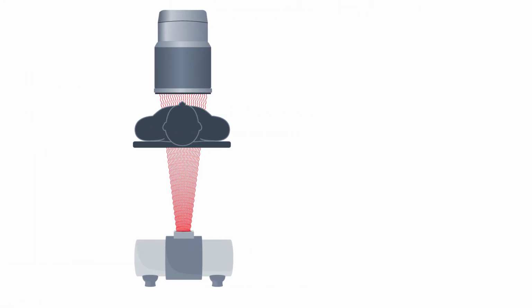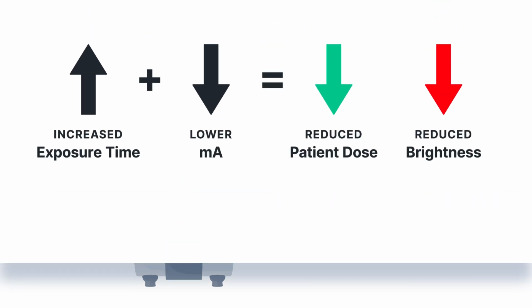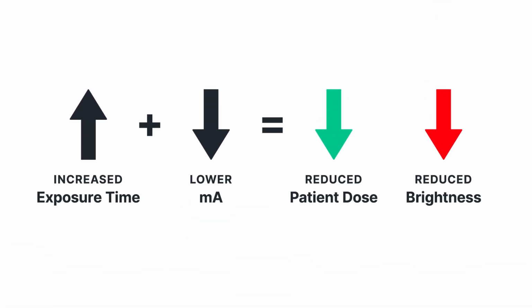In fluoroscopy, either a continuous or pulsed X-ray beam is used to create dynamic, real-time images of internal structures. Because of this increased exposure time, a lower mA is used to reduce patient dose, and because of this lower quantity X-ray beam, the initial fluoroscopic image is dimmer than those in static X-rays. The image intensifier helps to brighten the image by amplifying the lower quantity X-ray beam.